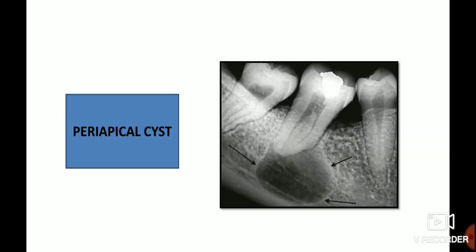Now let me explain another radiograph, which is a case of periapical cyst. Here there is periapical radiolucency measuring greater than 1.6 centimeters and lined by a corticated border, which is suggestive of periapical cyst.